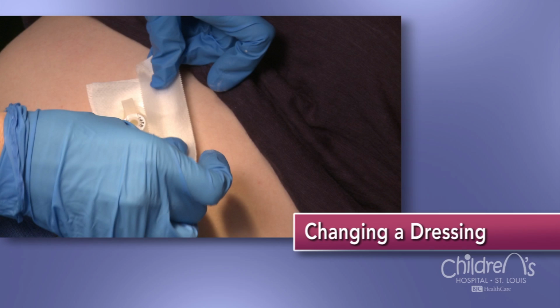Gastrostomy appliance sites rarely get infected, but leaking can commonly occur. A dressing may not be needed unless the site is leaking, or you are instructed by the surgeon to place a dressing at the gastrostomy site. Bath time is a good time to change the dressing. Unless there is a lot of drainage, buttons usually don't require dressings.